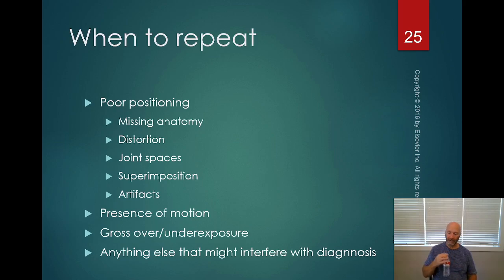But what you can do is take it and just drop it down in front of the patient, lower it down in front of the patient. And what that'll do is it'll take all those leads, all those lines, and it will pull them tight straight out in front of the patient. So you have less superimposition of those artifacts. So you can do something about them.